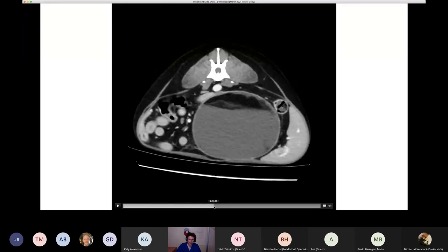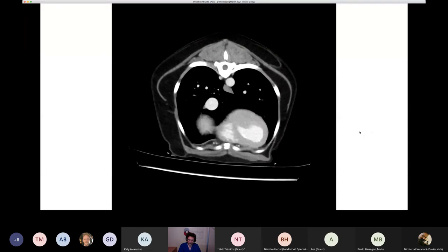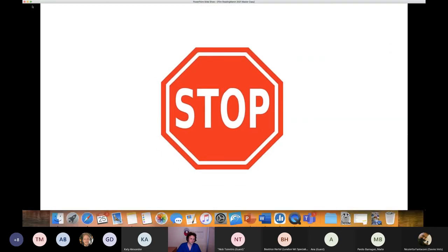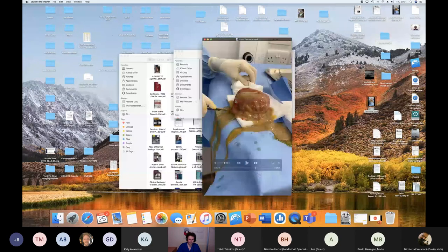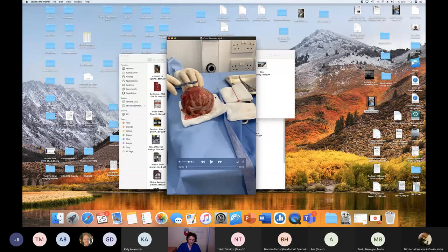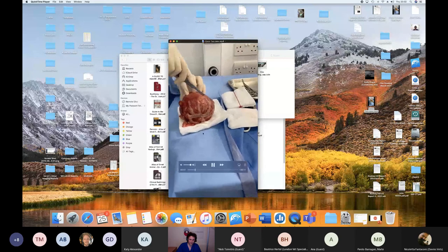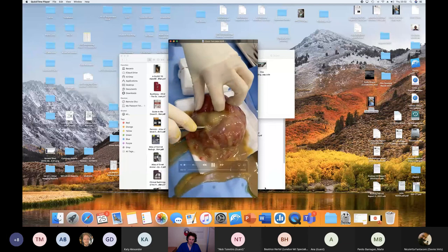Certainly what I expected when we CT'd this patient was a splenic mass, and that isn't what we ended up with. So what I'm going to do now is just minimize this for a second, if I can. I'm just going to show you guys just a little video. This is the video of this structure, and this is what it looked like when it was removed surgically. I would recommend that if anybody is eating their tea, they look away now, because it's not particularly pleasant. Okay, so I'll just play this video for you. It just looks a little bit like that. Okay, so this mass absolutely full of pus.